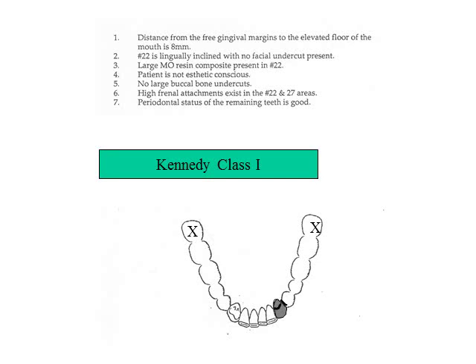Short guiding planes are used and a cingulum rest seat is prepared on the fixed restoration. The restoration is surveyed prior to cementation to certify the contours. Other mouth preparations involve a cingulum rest seat on number 27 with a short guide plane. The fulcrum line is now established.